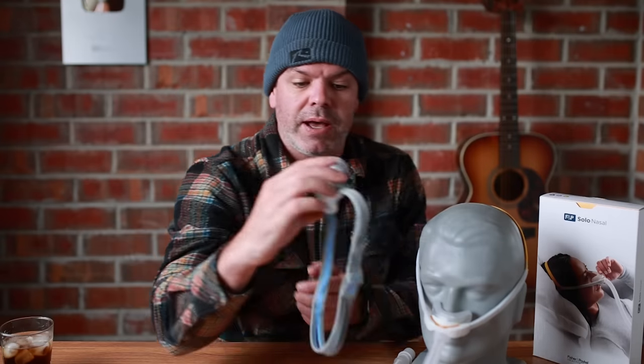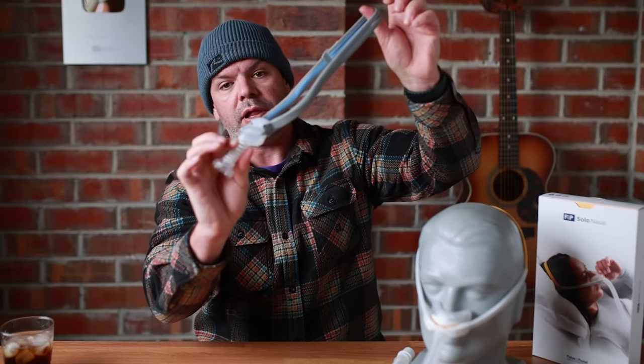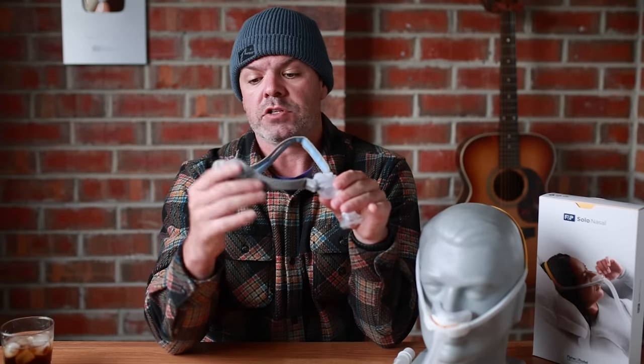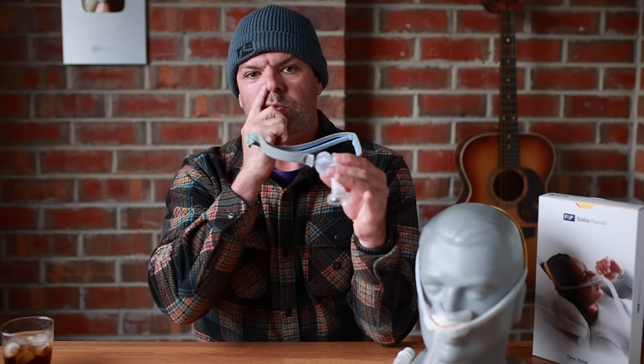With the ResMed P10 mask here, you can see as I release, it wants to pull into place. But if I want that a little bit tighter in any aspect, I have to try and tighten via this little clip here. And there's no way to make this little part a bit tighter or that little part a little bit tighter. Or if I want it looser, I do the clip again and just pull it out a little bit.